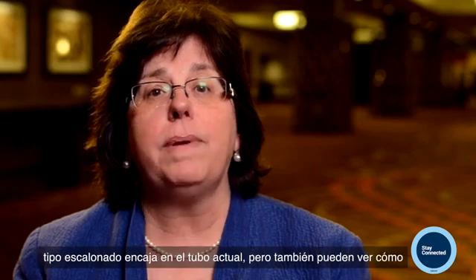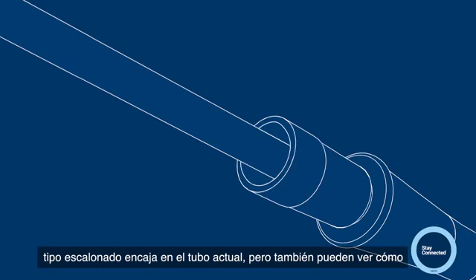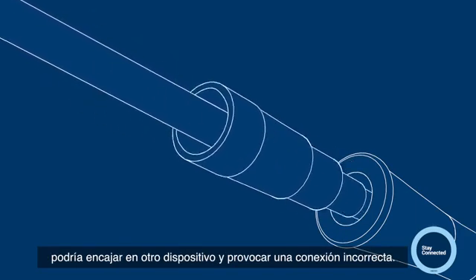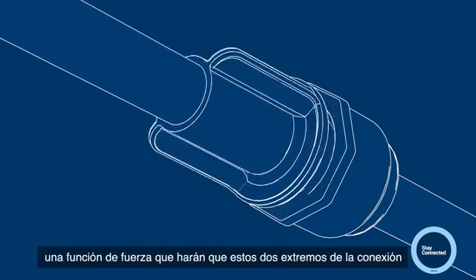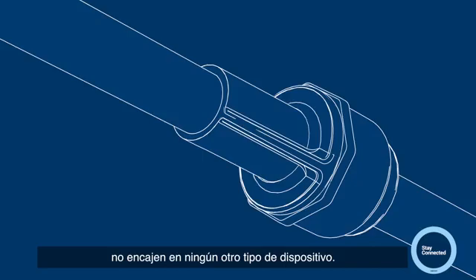Currently, you will see that the administration set with the Christmas tree connector will be fitting into the current tube, but you can also see how they might fit into another type of device and cause a misconnection. And so now with the new ENFit connector and making that connection, you will see that there is a rigid connector and that there will be a twisting motion and a forcing function created here where these two ends of this connection will not fit into any other type of device.